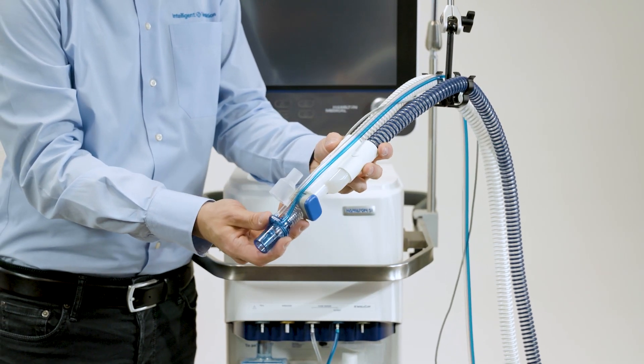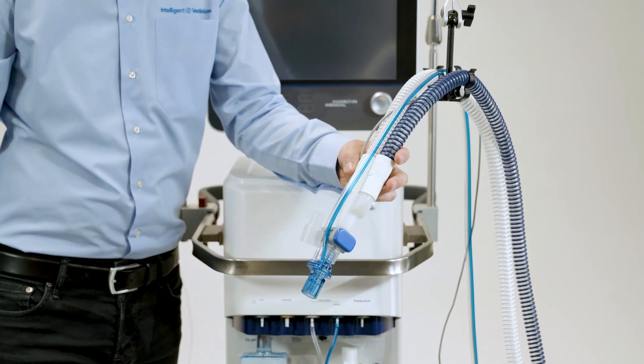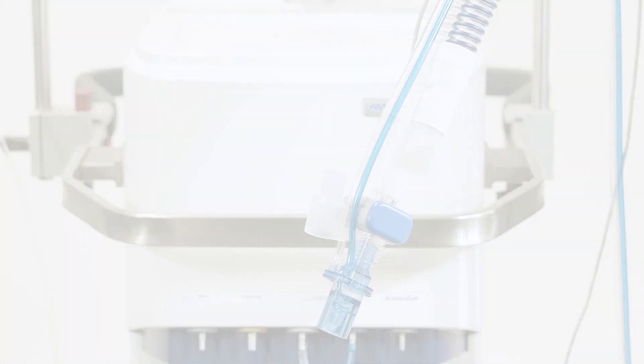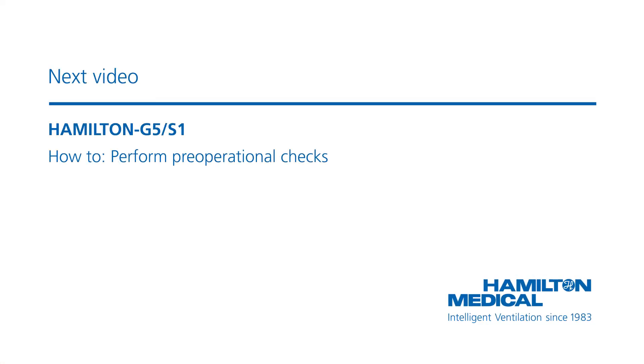Position the breathing circuit in such a way that the tubes will not be pushed, pulled, or kinked if the patient moves. The next step is to perform the pre-operational checks.